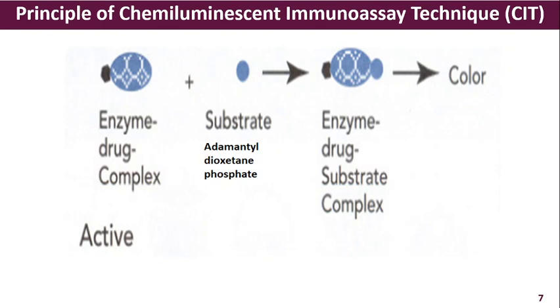In the luminescent molecule, there is no need of presence of light. It itself will emit light or photon at a particular wavelength.